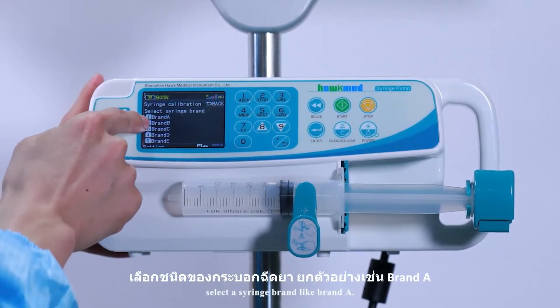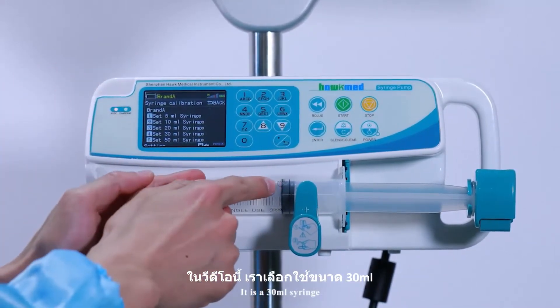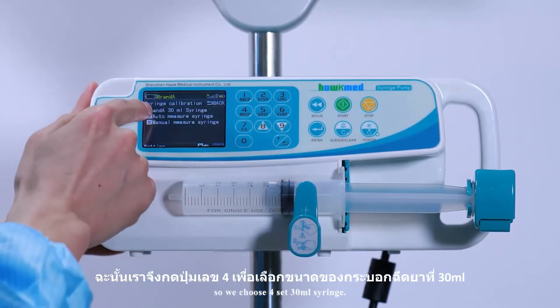Select a syringe brand — for example, brand A. Then select the syringe size. Since it is a 30ml syringe, choose option 4 and select 30ml syringe.